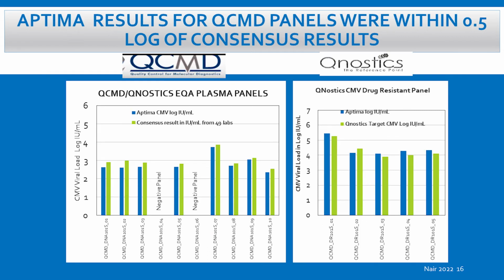And just like we do CAP testing in the US, the common panels to use in Europe are the EQA panels from QCMD, the External Quality Assurance Program in Europe. Here also the results from testing in Aptima were very much in line with the consensus result reported by the QCMD EQA program.